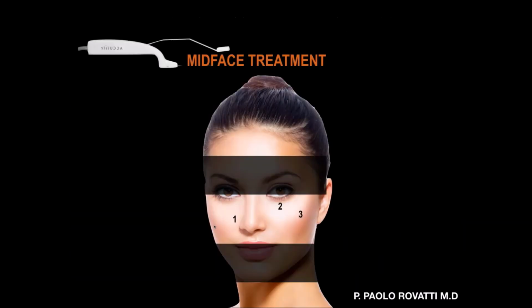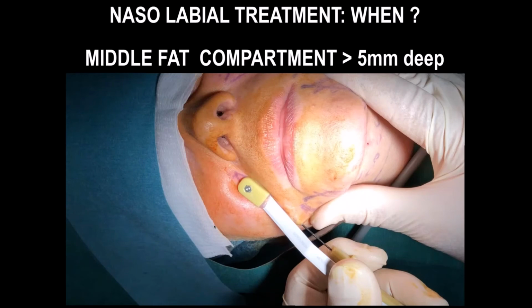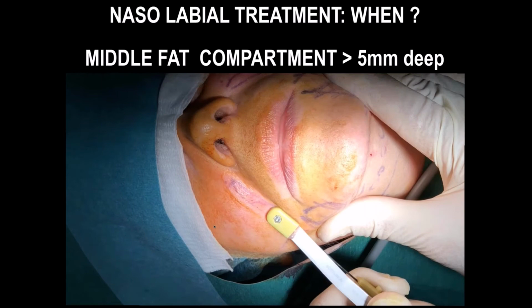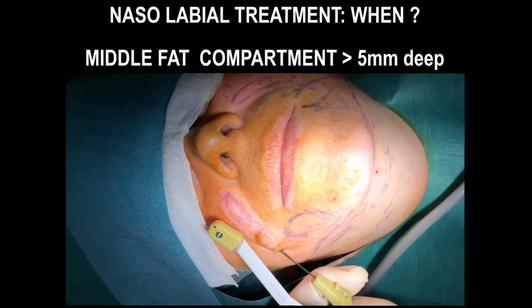And what about mid-face treatment? This is the first of the mid-face treatments, very easy. If we have the middle fat compartment, this is the fat just above the commissure, near the nasolabial fold. So I'm treating the superficial fat. Look, I'm putting the gel and I'm treating. This treatment needs 5 minutes.